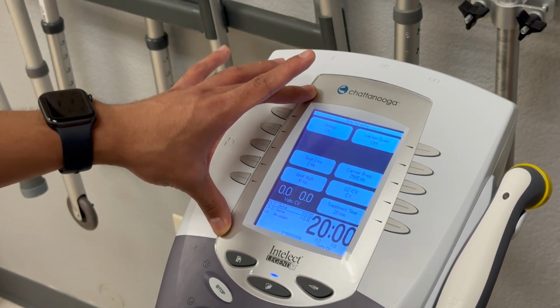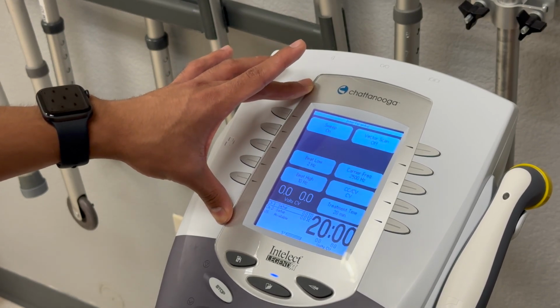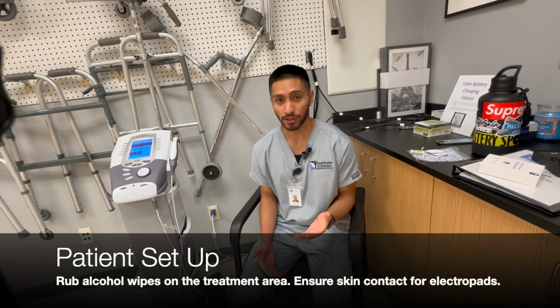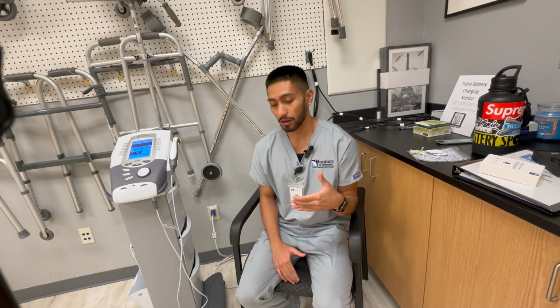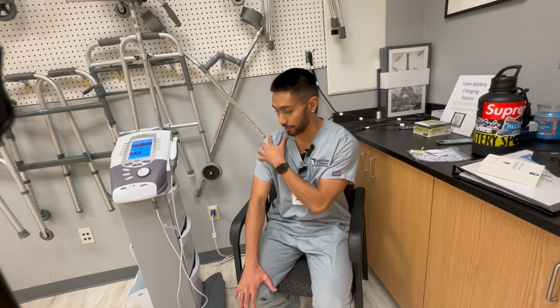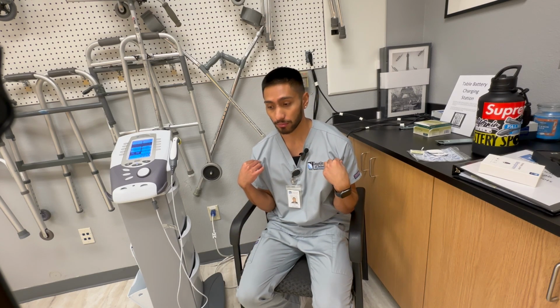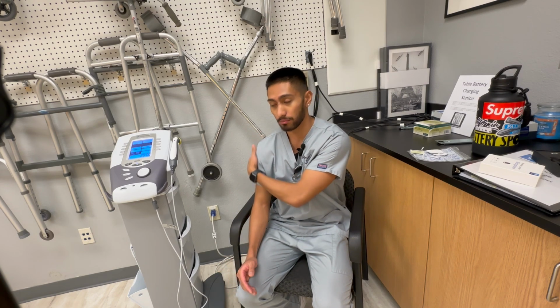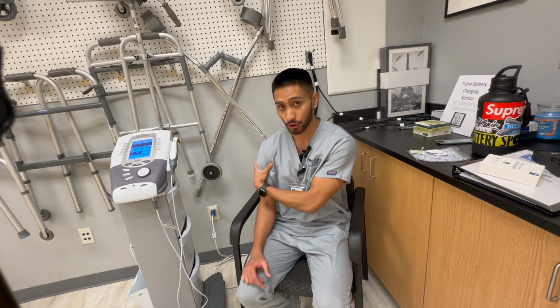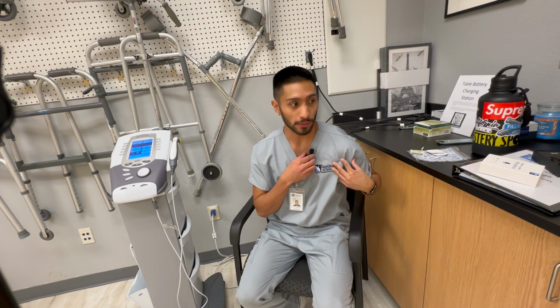However, let's go ahead with setting up how the patient would be. Today we're just going to be setting it up on myself. So to set it up on a patient, and for today's example, it's going to be myself, we're going to expose the area down to skin for the treatment area. I want to address my shoulder pain today, so I'm going to go ahead and remove my scrub top. I have a tank top underneath to just be able to be properly draped, covered up, but my shoulder will be nice and exposed for me to place the electric pads on there. So I'll have my scrub off.